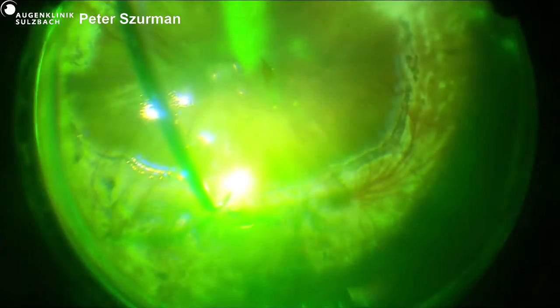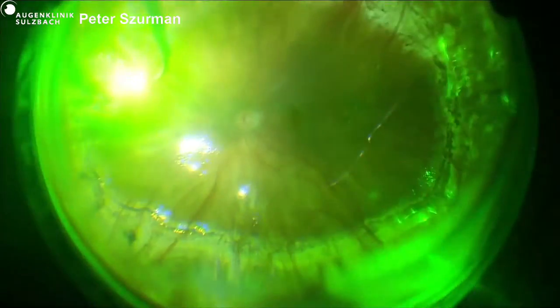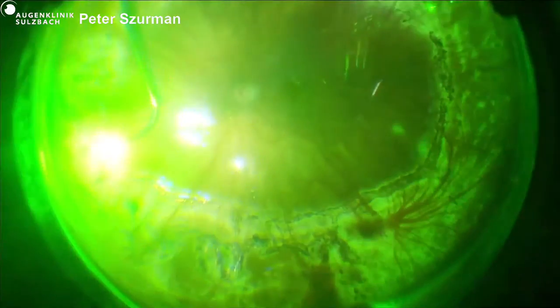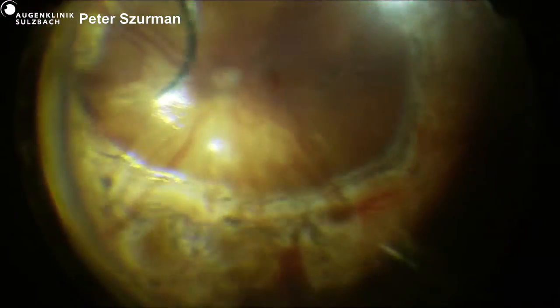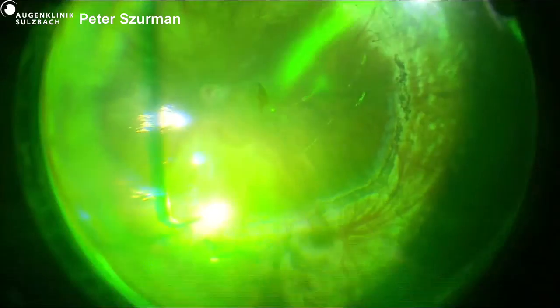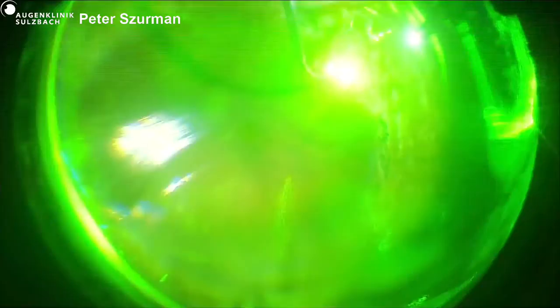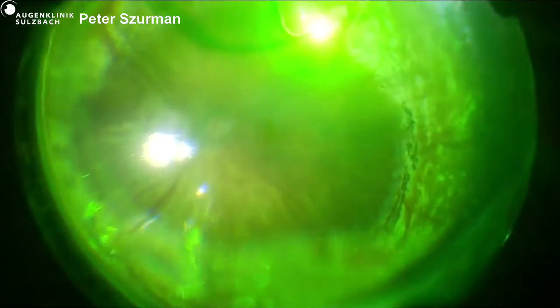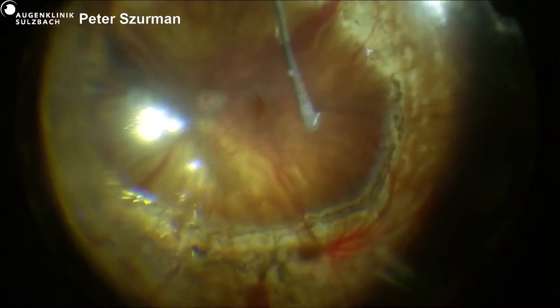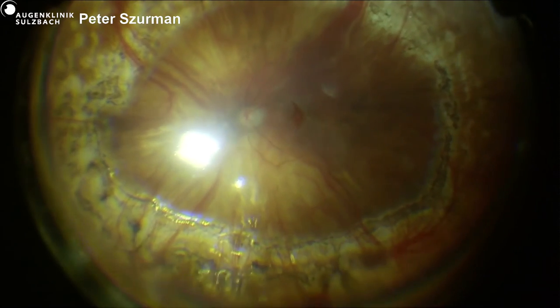Yes. Peter, basically, I don't see a lot of PVR, even in the periphery. I don't see peripheral breaks. It seems to be exclusively caused by the central break, so a highly myopic retinal detachment due to a large, possibly iatrogenic macular hole. And so the laser is not really necessary. I just add some very slight laser burns, and that's it. And the only idea I have to add possible healing incentive is the epimacular amniotic membrane. We can discuss it in a panel.